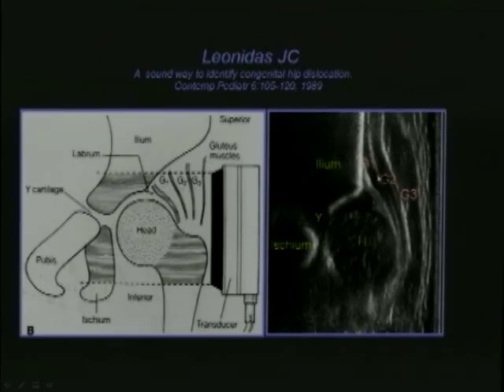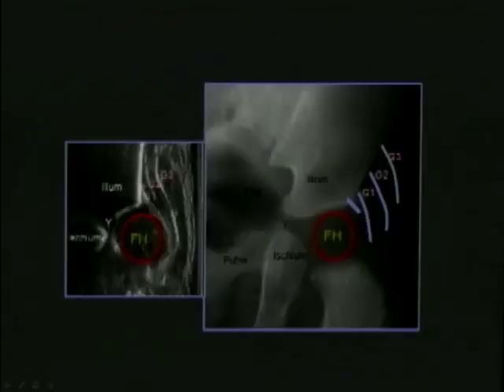Here's gluteus minimus, medius, and maximus, the subcutaneous adipose tissue, and the dermis. Here we can see the ultrasound in comparison with an X-ray and see how well we can see the head by comparison on the ultrasound because it shows cartilage beautifully, and this is where we would extrapolate the head to be along with the gluteal muscles.